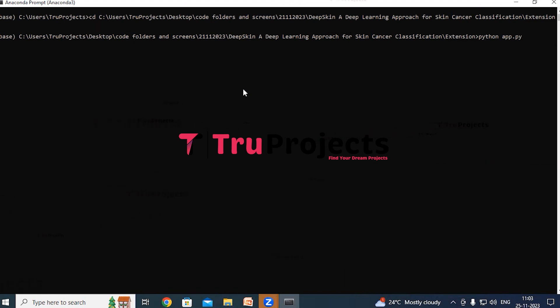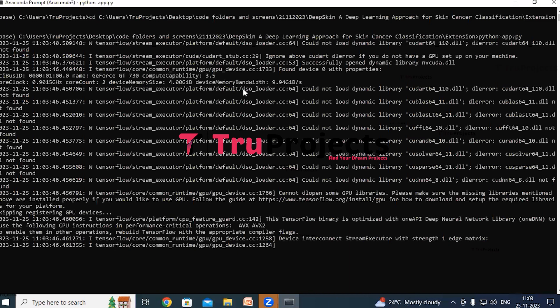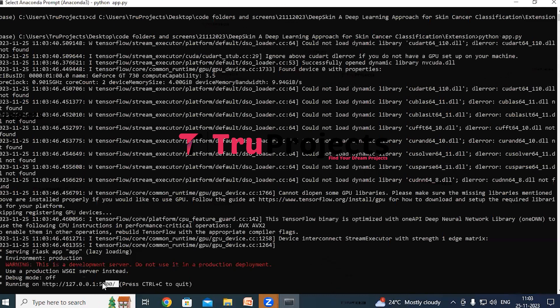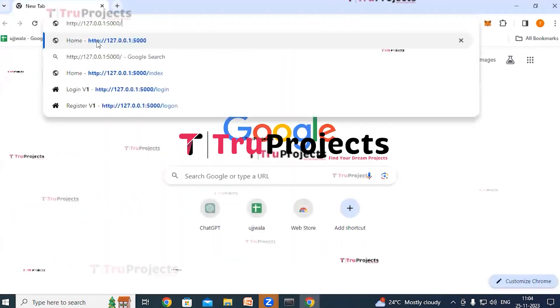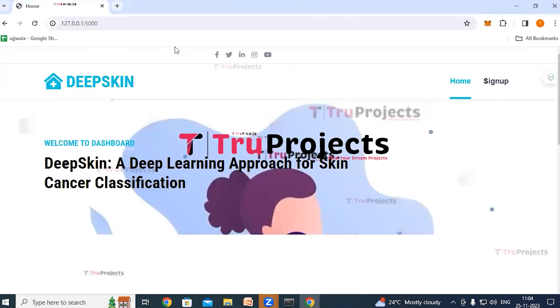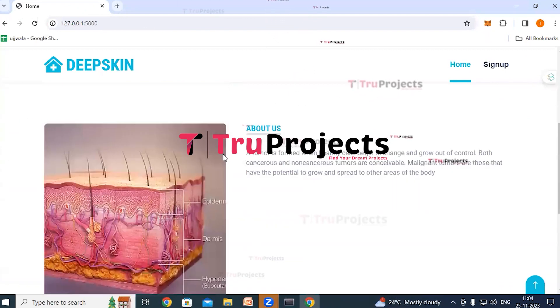This command will execute the Python script and perform a runtime check for any syntax errors or logical issues. After running app.py, the Flask framework will host the application locally at the default localhost address. Copy the local link provided by the framework, paste it into a web browser, and hit Enter to open the home page of the project.